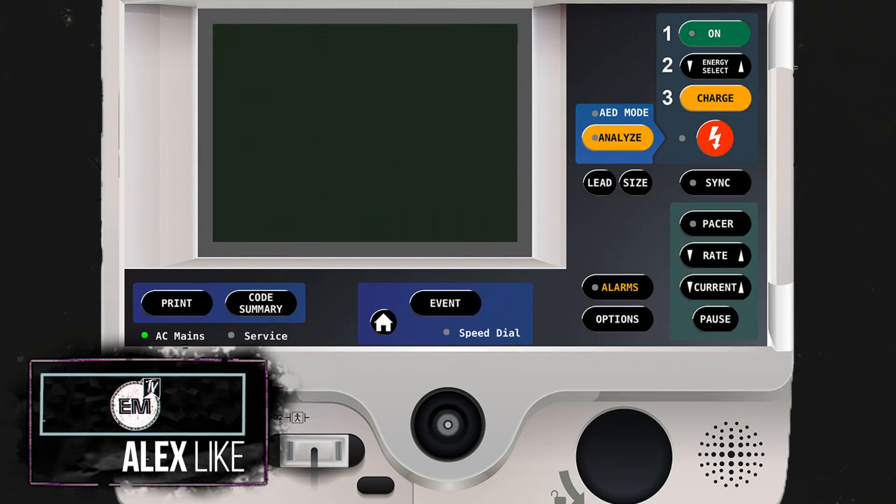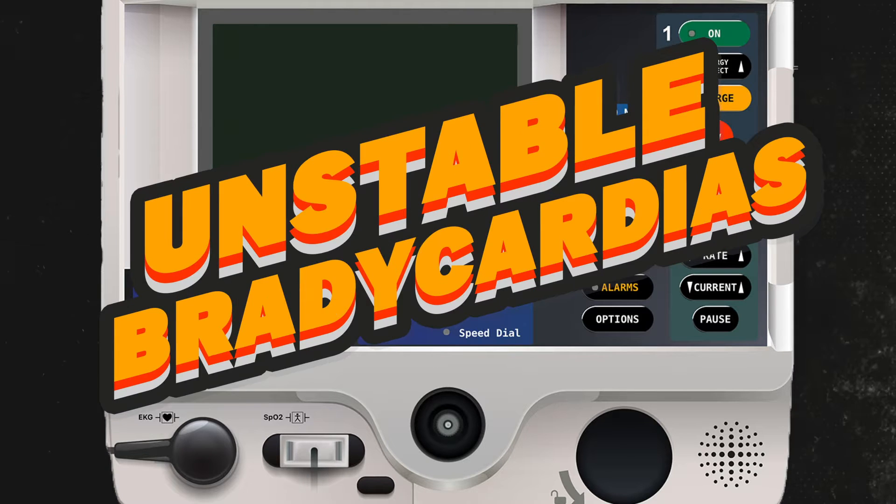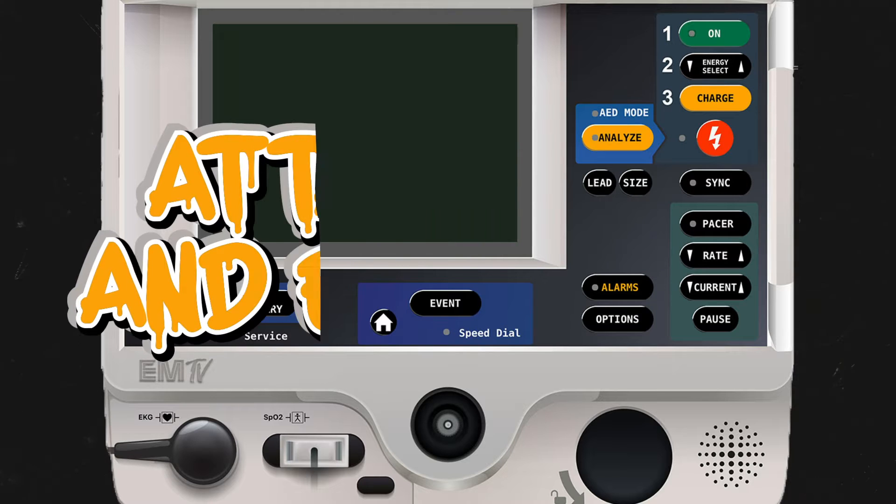Hey everyone, in today's video we're going to talk about transcutaneous pacing. Of the primary modes on the Lifepak 20, transcutaneous pacing is the function that is probably least frequently used. Pacing is performed on unstable patients in bradycardic rhythms.